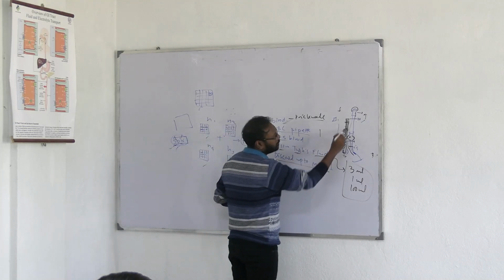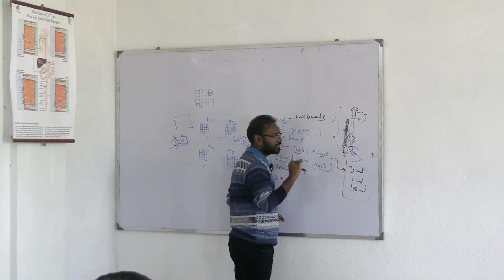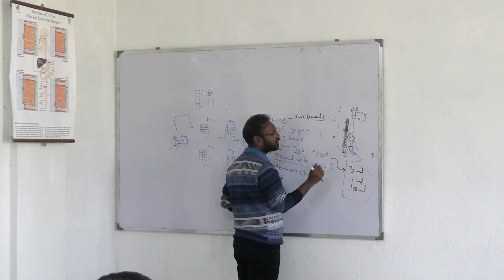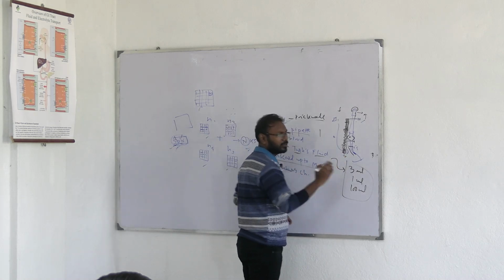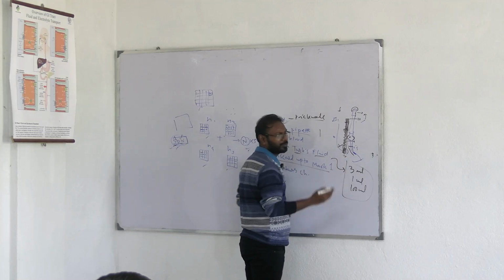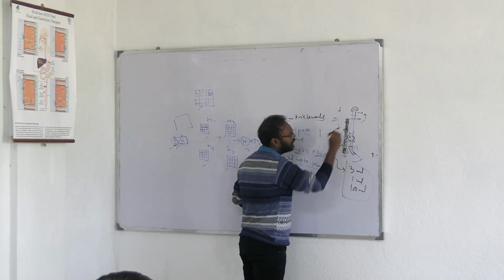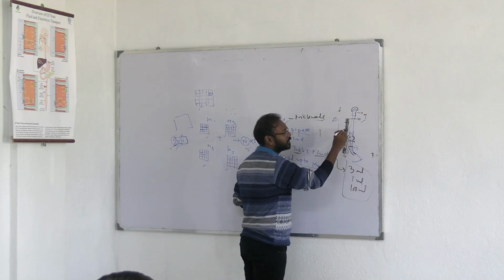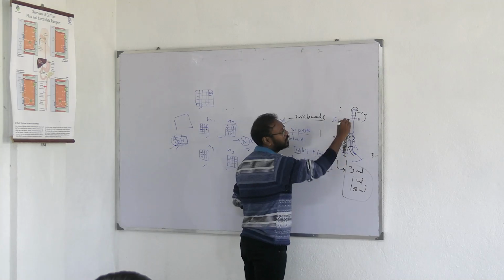Think about it: the blood has gone this far. Even if you mix, the mix is not very uniform because this capillary tube is very thin. The diameter is very small. So in the distal, meaning the furthermost part, the mixing will not occur properly. The main mixing occurs where the blood is in direct contact with the fluid, here. So these distant fluids will not be able to mix with the blood properly.